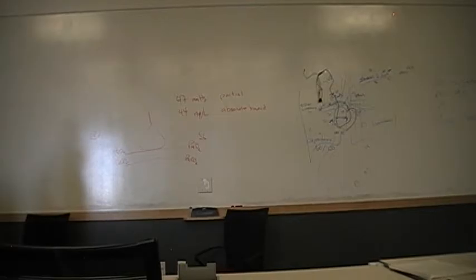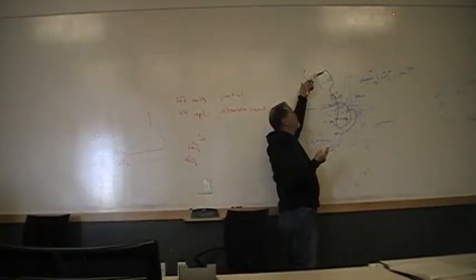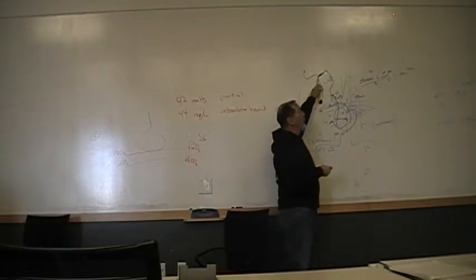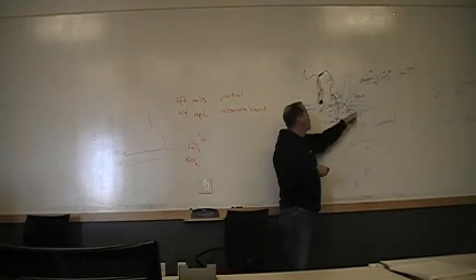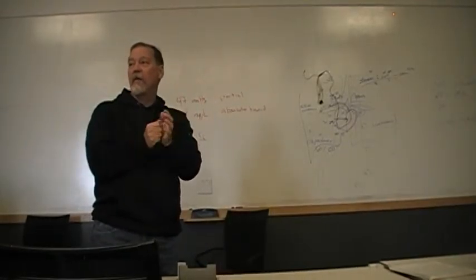The thing with a pulmonary artery catheter is that it's invasive, it's cause for concern because of infection. You know, if we're messing around with these ports out here, drawing blood, you know, we'll take off the cap on this one, roll it around in our hand, and stick it back on that thing. You know, we're introducing whatever was on our hand into that catheter, and then that gets into the patient's central circulation. So it's a place ripe for infection. That's why we wear gloves.